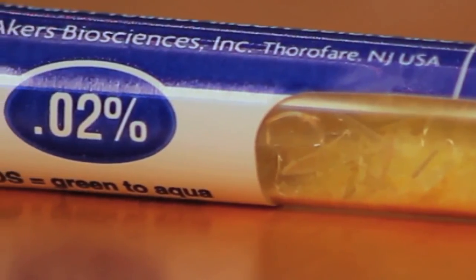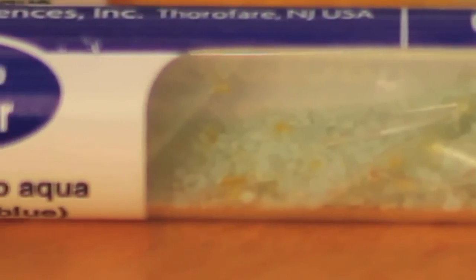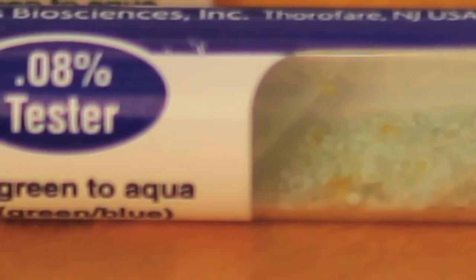If the crystals are mostly aqua, green, blue, or blue-green tint, this means the subject's breath alcohol level is at or above the number stated on the tube.